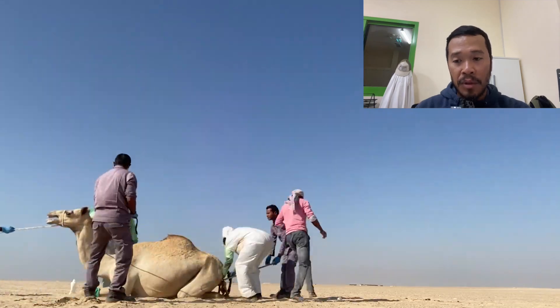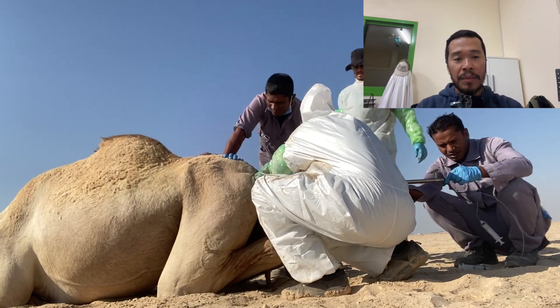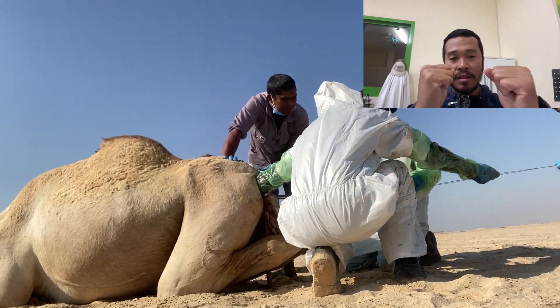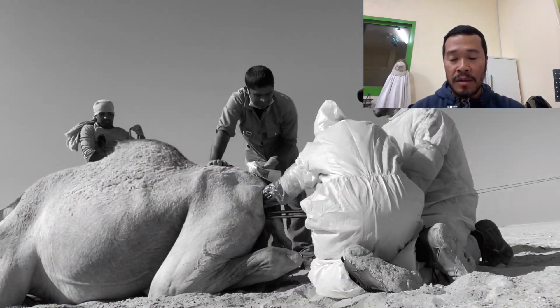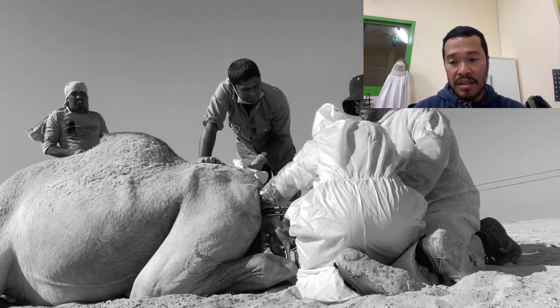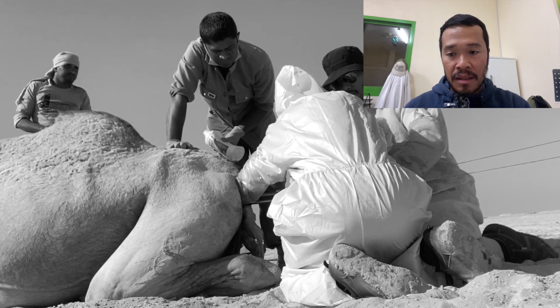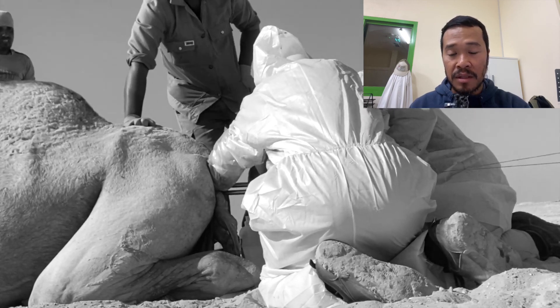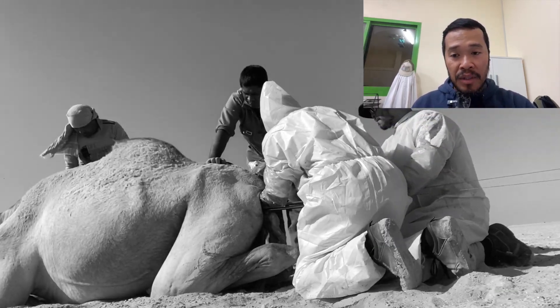The fetotomy tool is a stainless steel metal tube about one and a half meters long with two openings so you can insert the wire on both sides and perform a sawing action. We first had to place the animal in a seated position to safely do the procedure. This is not a two-man job — you need a minimum of five or six people because it's a large animal that must be properly restrained.